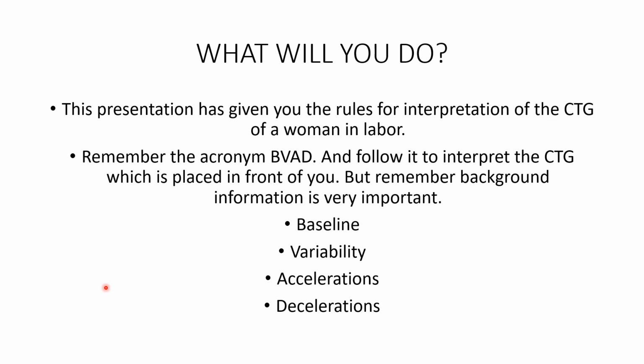So this presentation has given you the rules for interpretation of the CTG of a woman in labor. Remember the acronym BVAD and follow it to interpret the CTG which is placed in front of you. But remember, background information is very important. So baseline, we have defined what is the meaning of baseline, variability, accelerations and decelerations.